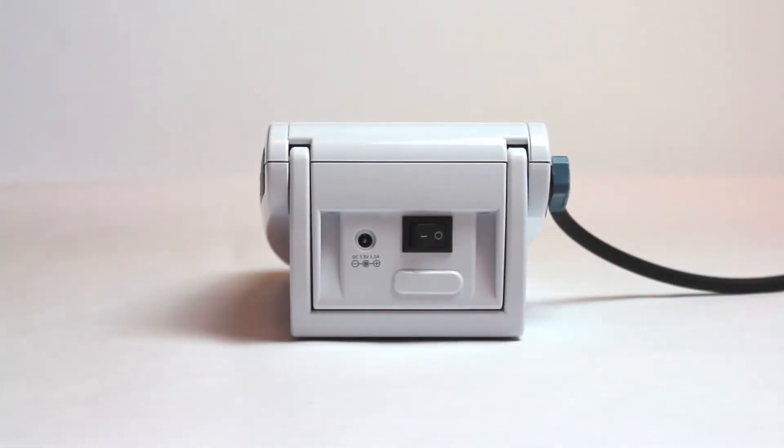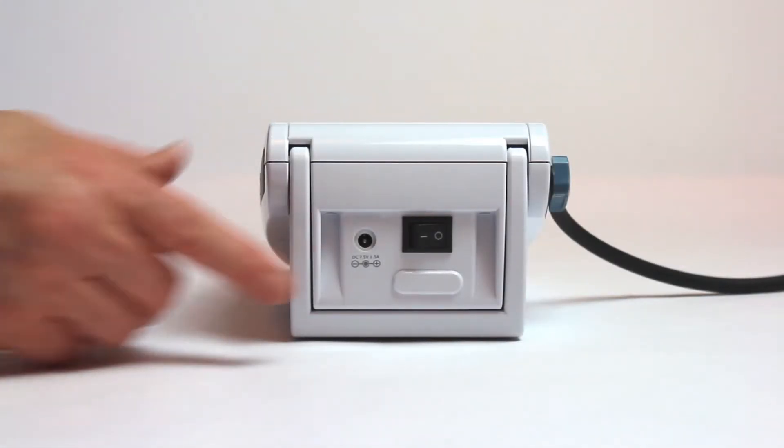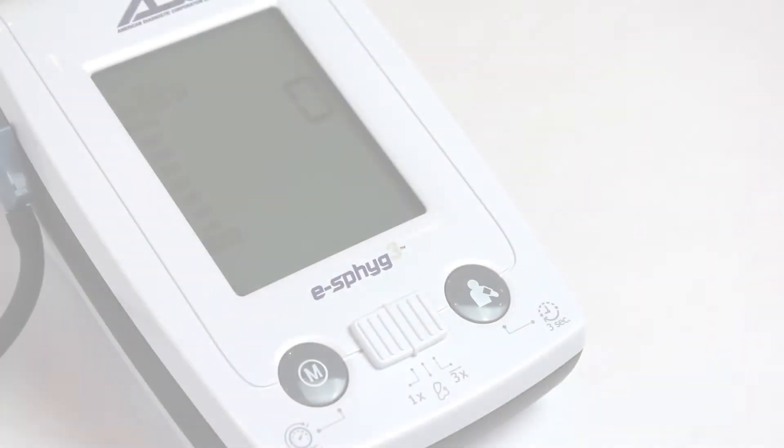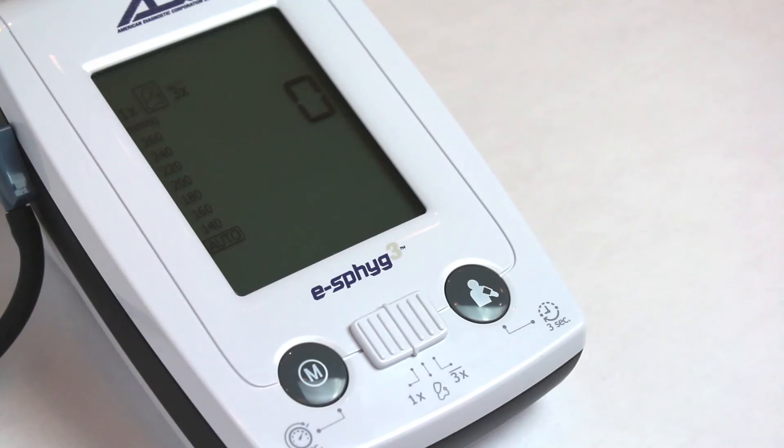If the device is off, press the power button on the back of the unit. If needed, slide the mode switch to the left to select 1X or Single Measurement Mode.